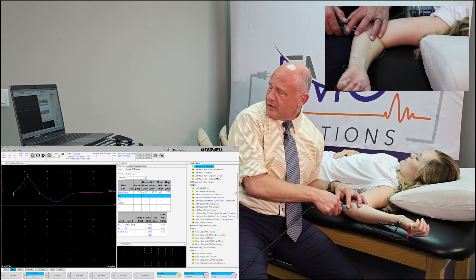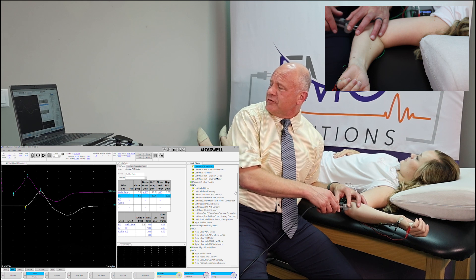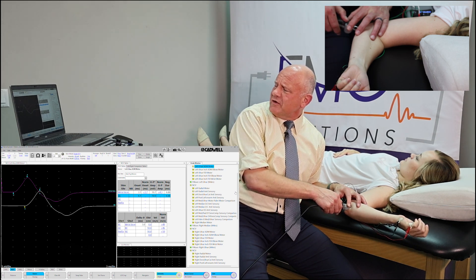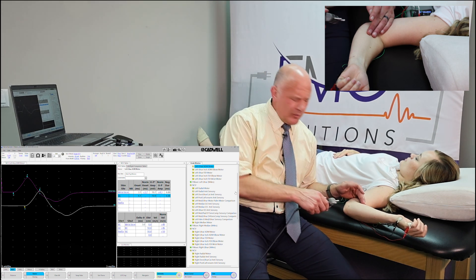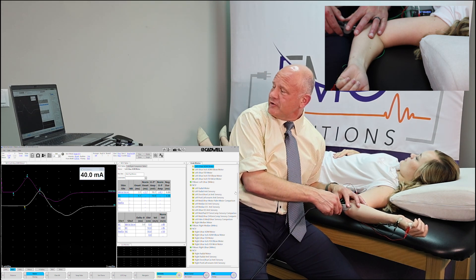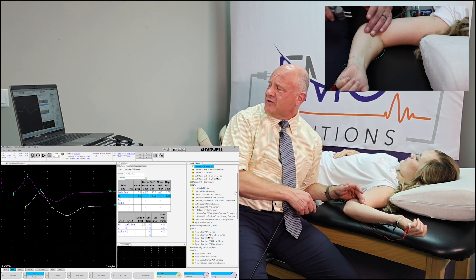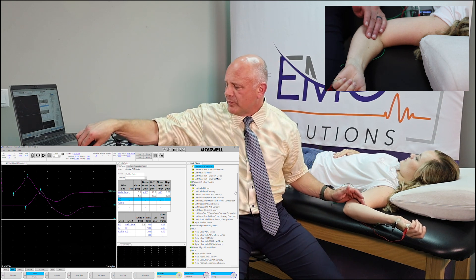Now we'll come down to the elbow and stimulate right here. I'm going to check the amplitudes — the amplitudes are identical. We'll give it just a little more stimulation. We got just a touch more, but our baseline also changed slightly, so I'm going to back it down just a touch. There we go — cleaner baseline, and our response is very consistent with what we had at the wrist.